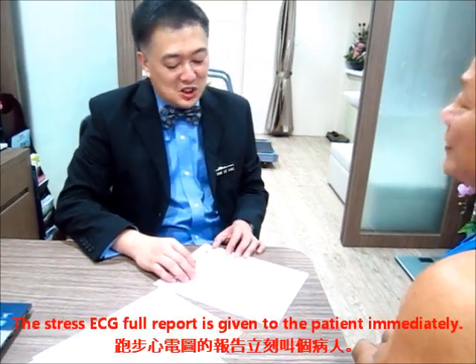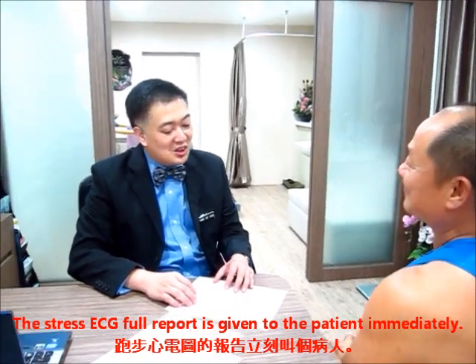The ECG showed no problems, so I was confident to ask you to continue to stage 4. Reaching stage 4 already reflects a very healthy heart, but to make the report more detailed and reliable, and given your excellent stamina, we continued to stage 5. You ultimately reached 100% of the target heart rate with no abnormalities on ECG at any stage. This report is very clear — all five stages completed, 100% achieved, everything normal. I sincerely wish you good health and hope your heart remains problem-free. Your level of fitness is an example for many people. Thank you.